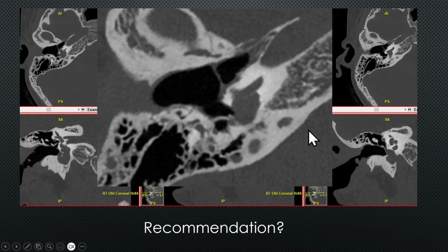And this is a closer up view on the photon scanner. You can see the base of the cochlea here, and you can see a thin rim of differentiation there, and then this lesion.